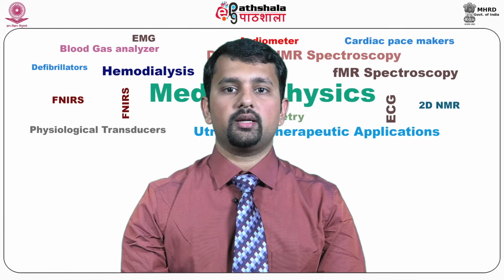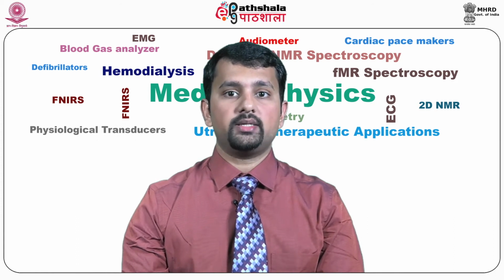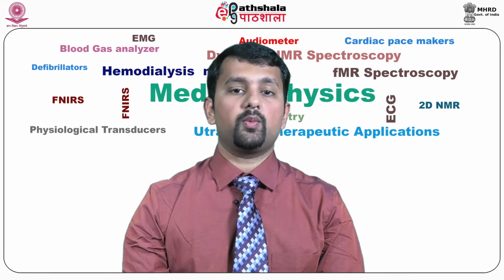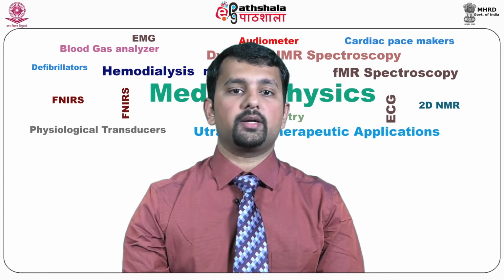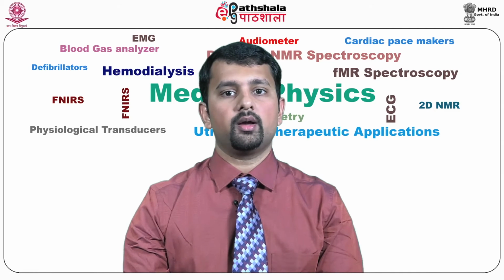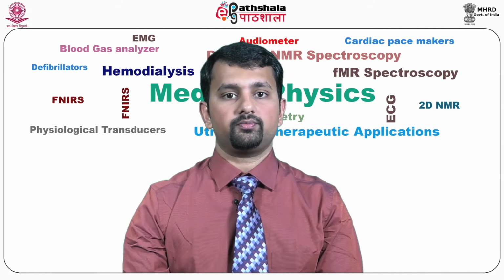Application in breast imaging. The two main potential clinical applications of proton MR spectroscopy are as an adjunct to breast MRI imaging to improve specificity in differentiating benign from malignant lesions. The diagnostic value of proton MR spectroscopy in cancer is based on the detection of elevated levels of choline compounds, choline being a marker of active tumor growth.